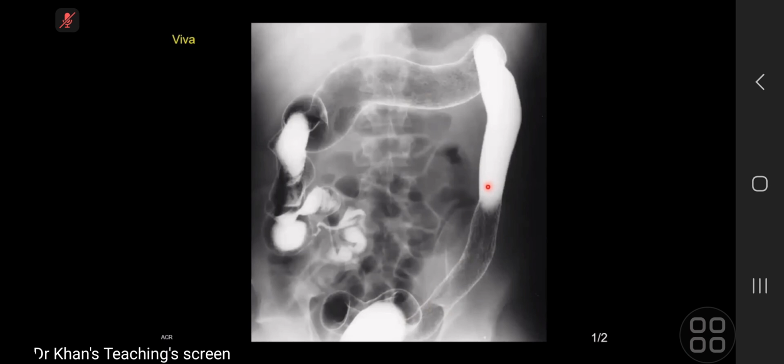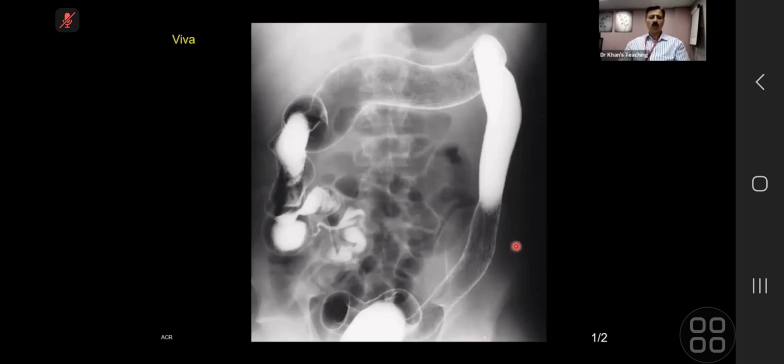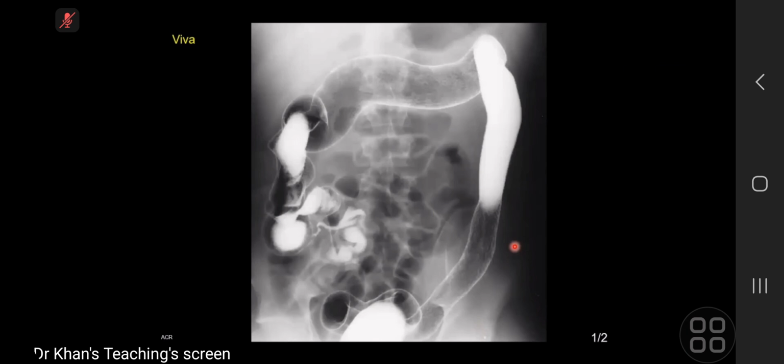Typical barium contrast enema, demonstrating loss of haustra and visualized sigmoid, descending, transverse and ascending colon on this single spot film. This almost lead pipe kind of appearance of the colon. There is probably some... Excellent. So what is your conclusion? The features are consistent with ulcerative colitis.